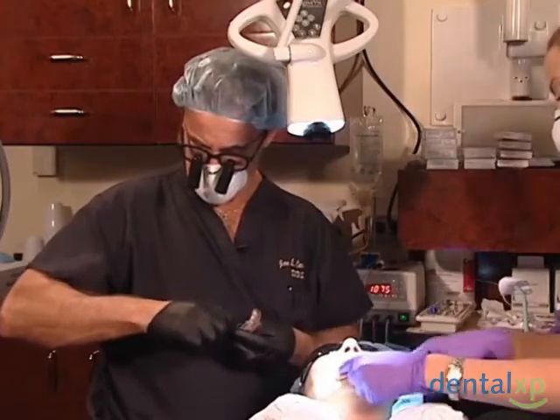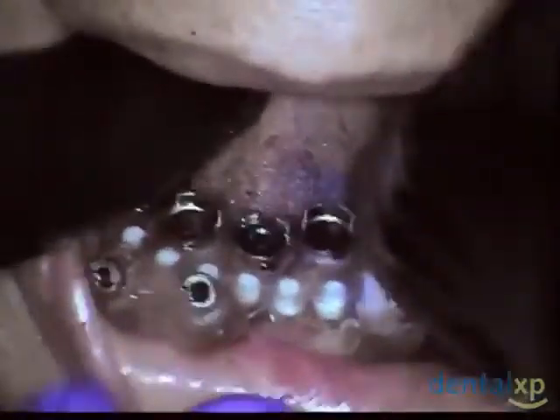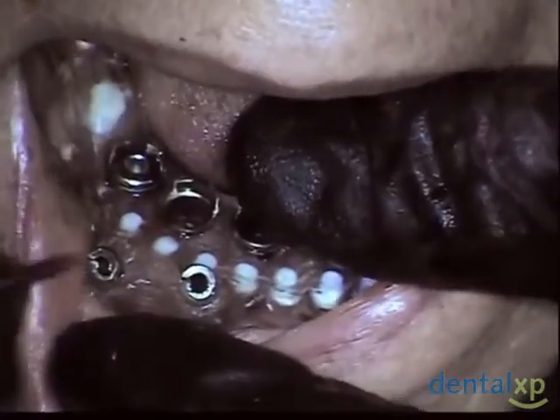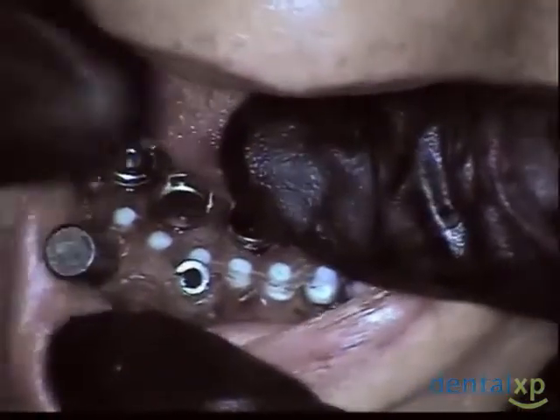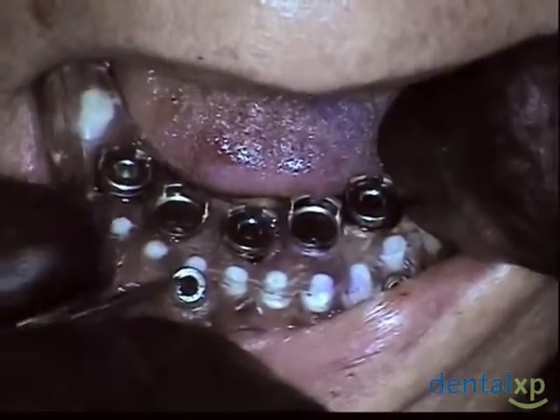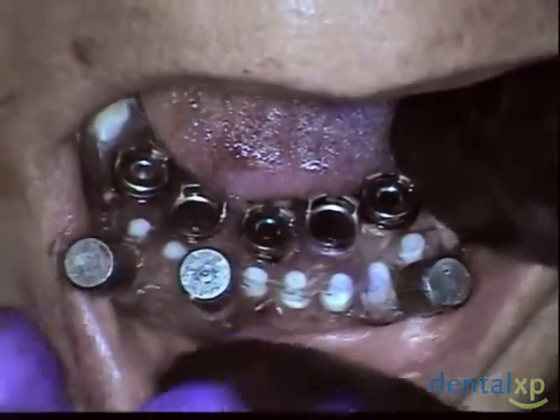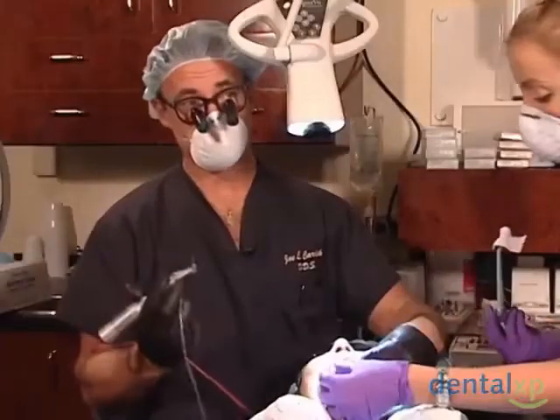In this case, it's the ERA. And I think you can readily see how nice it is to have these securing pins, because I've taken this out now a couple of times. It might be a little more challenging to make sure I've repositioned it, although in her case it seems fairly easy to do. The accuracy of this is such that I can get within 0.2 of a millimeter of where I want to be, provided I place it in the same position each time. And I would like to think I was good enough to do that, but 0.2 of a millimeter isn't a whole lot of variation.